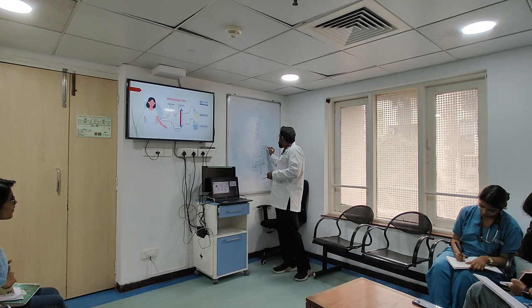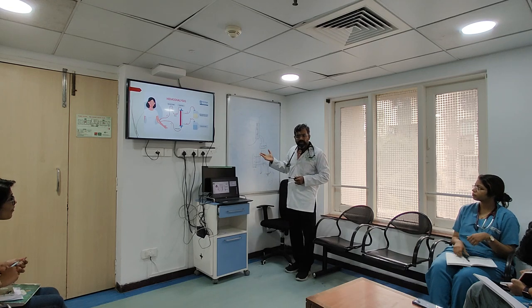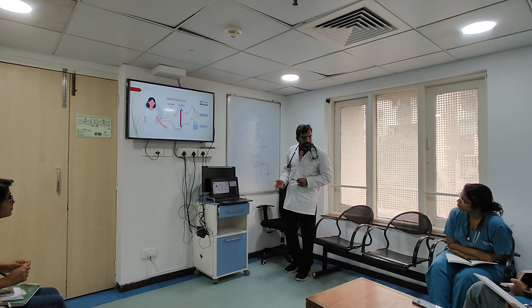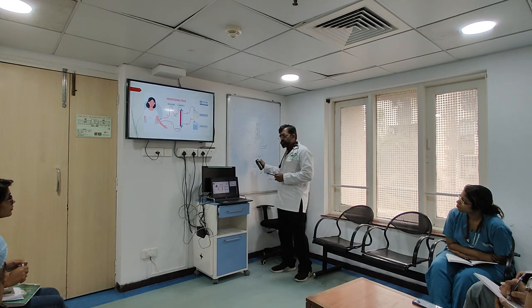So if I want to understand whether my machine is working well, I have to calculate my effluent. If I want to know whether my therapy is working well, I calculate my effluent. How much is coming out? Are you understanding? That's what effluent is all about. Clear about effluent? So, understood diffusion? You understood this diagram?